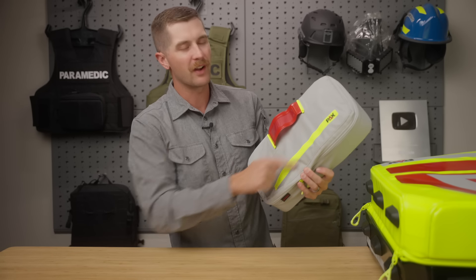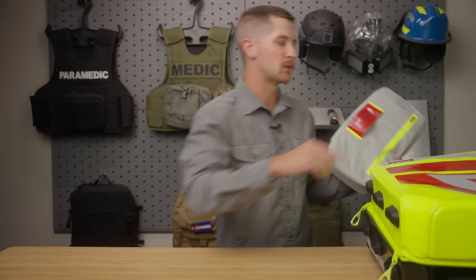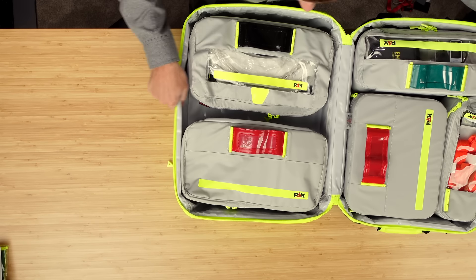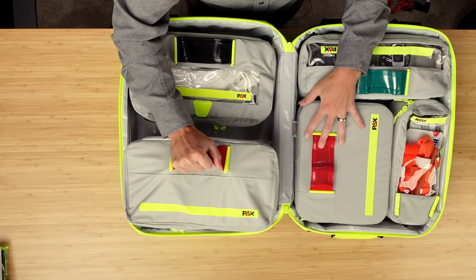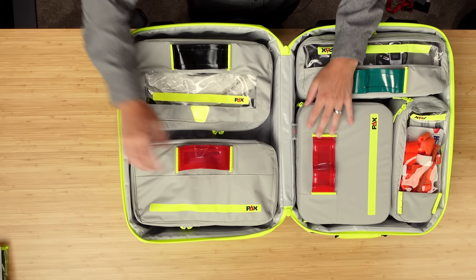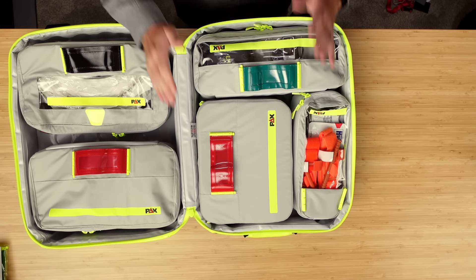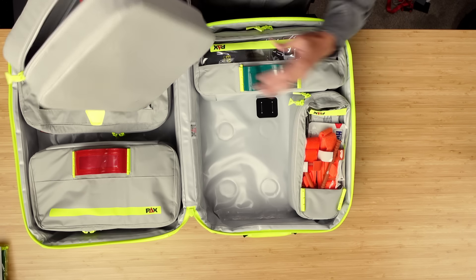I do believe you can also modify the colors of these stripes when you buy them on their configuration tool. And you hear that snap — it's kind of satisfying. Not going anywhere. Over here, this is one of the more unique pouches and I want to spend just a little bit more time on it.